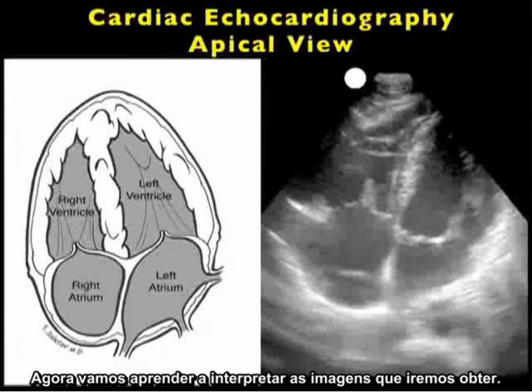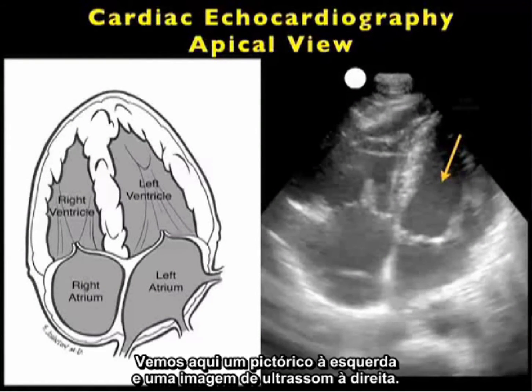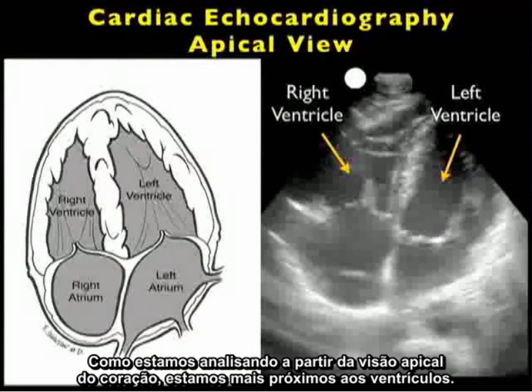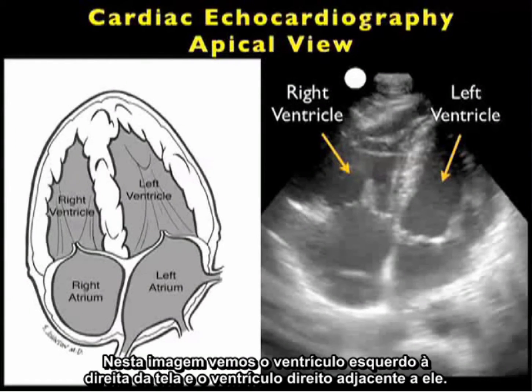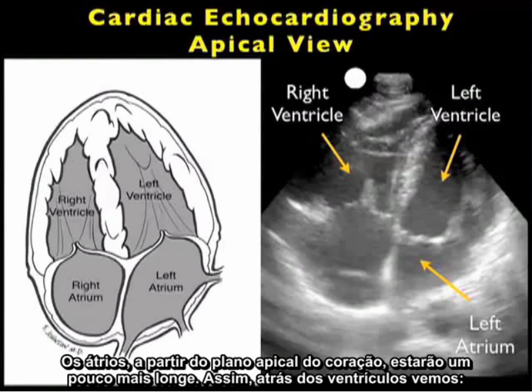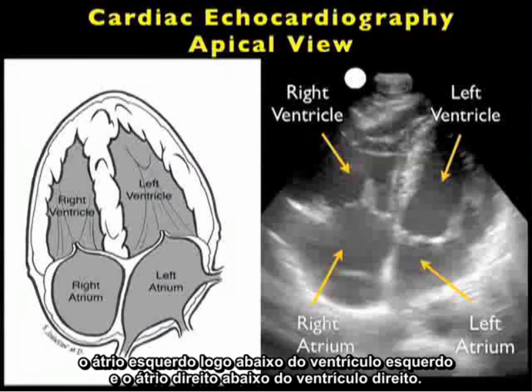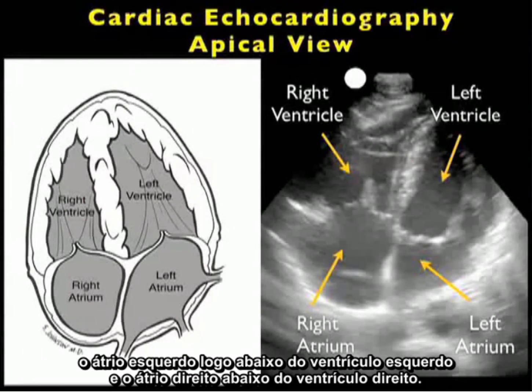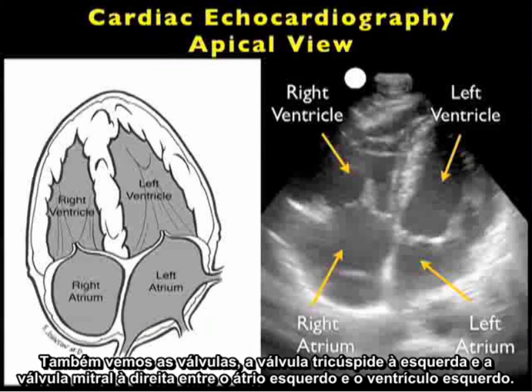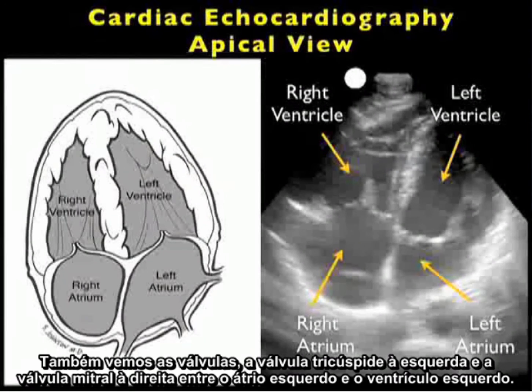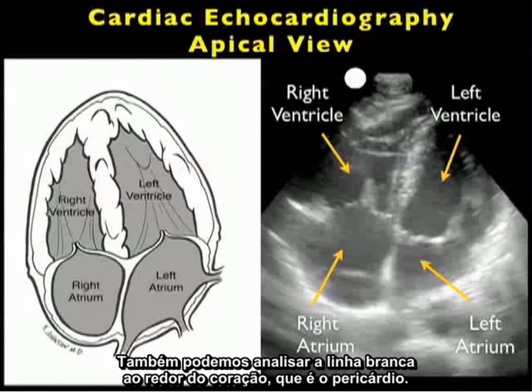Now let's learn how to interpret the images we'll obtain. We see here a pictorial to the left and an ultrasound image to the right. As we're imaging from the apical view of the heart, we're closest to the ventricles. We see the left ventricle to the right of the screen and the right ventricle adjacent. The atria will be further away, posterior to the ventricles — the left atrium just below the left ventricle, and the right atrium below the right ventricle. We also see the valves: the tricuspid valve to the left, and the mitral valve to the right, in between the left atrium and left ventricle. We can also appreciate the white lines surrounding the heart, which is the pericardium.